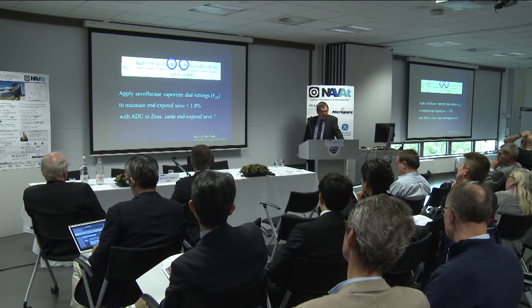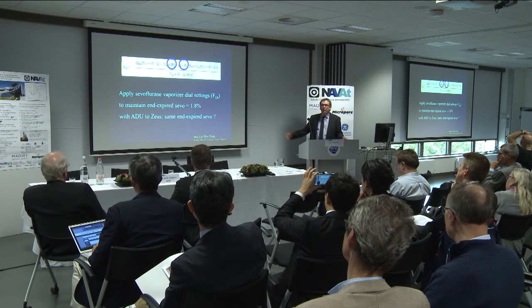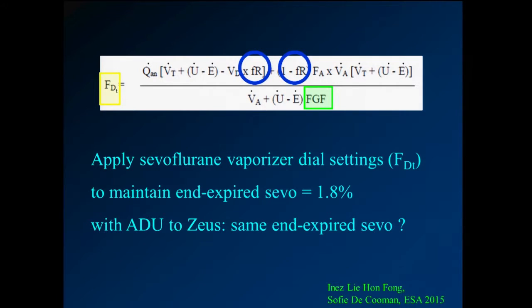We also said, well, why don't we go ahead and compare the ADU with the Zeus also? So we previously did studies in which we looked at what kind of fresh gas flow and vaporizer dial settings we needed with the ADU to maintain a certain end-tidal concentration. We now applied those to the Zeus. This is something that Sophie presented at the ESA this year.